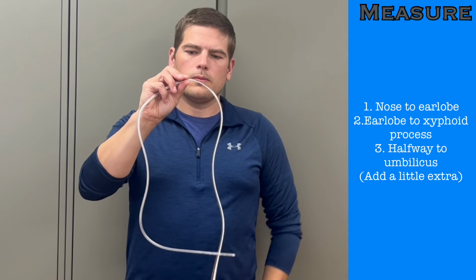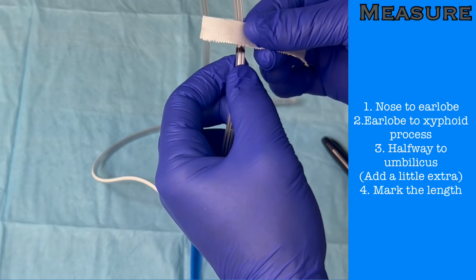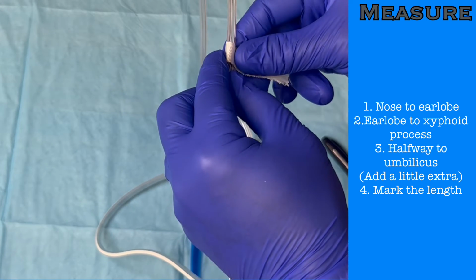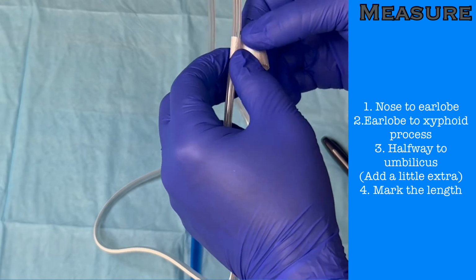Once you have the measurement, mark it. You can use a permanent marker to draw a line at the correct measurement, or you can use a piece of tape to mark the length. I prefer the tape method because I find it easy to lose sight of the marking while inserting, but the tape ensures you'll stop at the right distance.